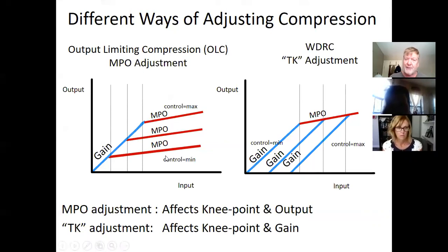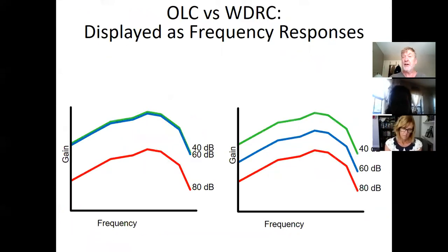So you can think of the left as governing or controlling or dealing with the ceiling, and you can think of the right as governing or controlling or dealing with the floor. Very different approaches. The right is for mild to moderate sensory neural loss, where outer hair cells are the pathology. The left would be for severe hearing loss, where the damage is done both to outers and inner hair cells.